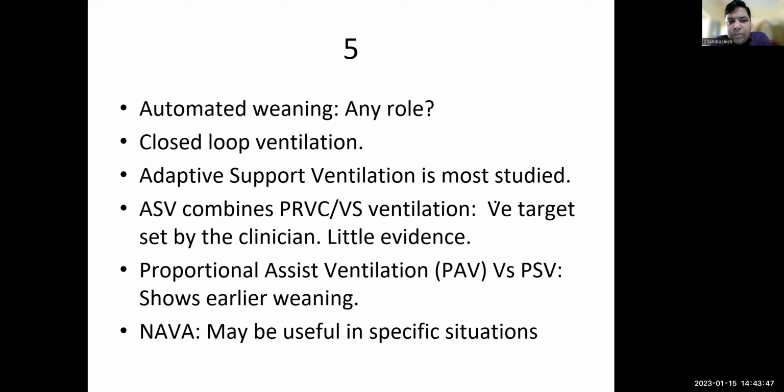There is little evidence to say that ASV is better than the traditional weaning modes like pressure support or just spontaneous breathing trials. It probably has a role in weaning patients in ICUs which are not very regularly staffed with intensive care physicians, like cardiothoracic ICUs, or ICUs in peripheral small hospitals, mostly run by nurses and maybe controlled by intensive care physicians over telemedicine. So these ICUs will probably benefit from such modes.